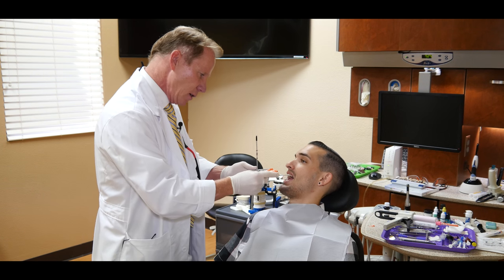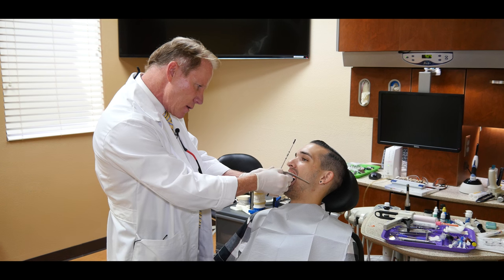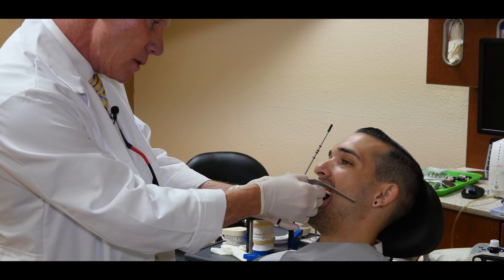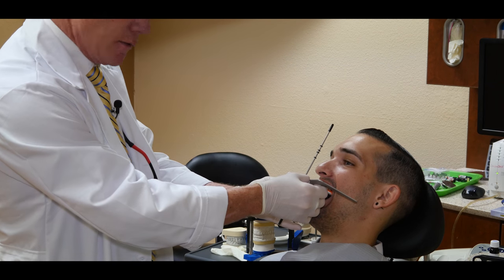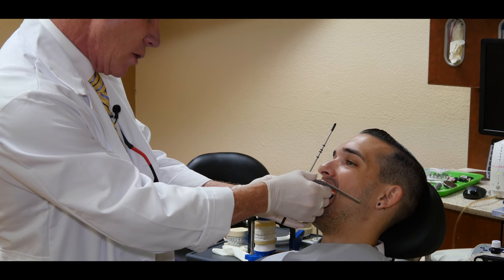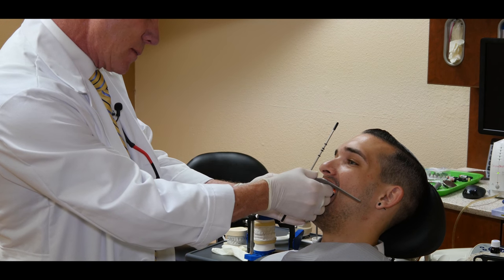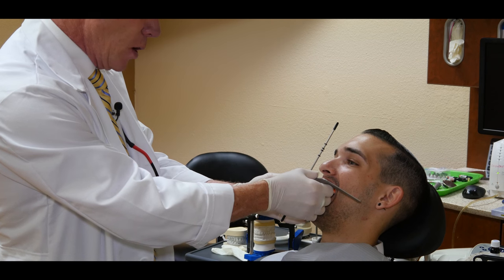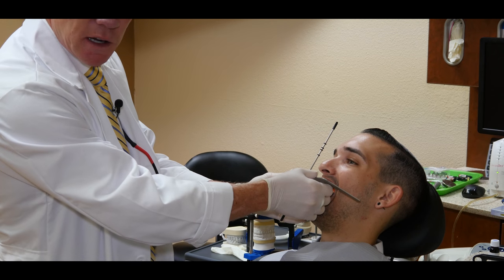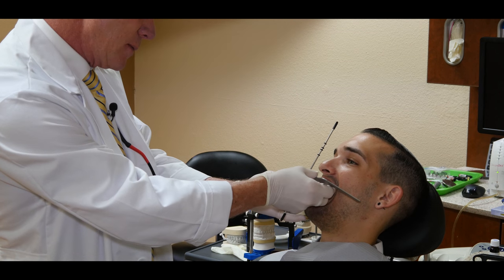Turn toward me, chin down a little bit. Again, the back side of the plate away from the teeth, the two centrals on the flat of the plate and against the front of the plate. And then we're just going to rotate the back up, making sure that the horizontal bow is parallel to the interpupillary line as well as his occlusal plane.